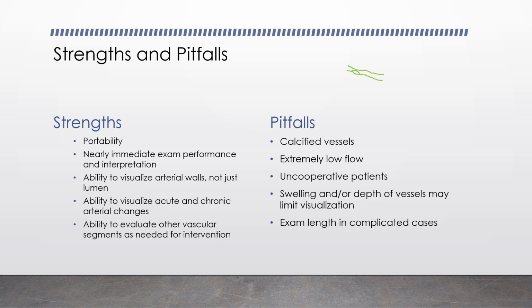And some patients have thicker legs than others, whether it be muscular or soft tissue. And so some of that depth can really affect our ability to pick up flow. Sometimes these patients can be uncooperative, which always makes things more challenging. And other times they may have other significant health issues, significant swelling, maybe cellulitis, things like that can cause a lot of pain and make them very difficult to visualize. Finally, the exam length can be really long and uncomfortable for the patient and a lot of work and challenging for the technologist. So that's something certainly to keep into consideration, especially if you're doing these bilaterally.